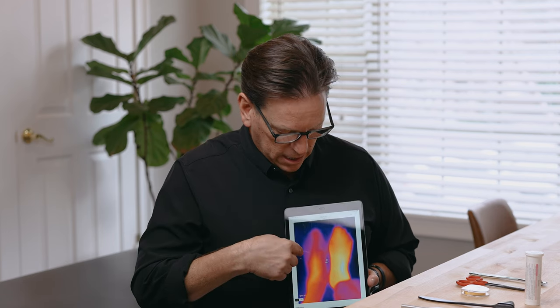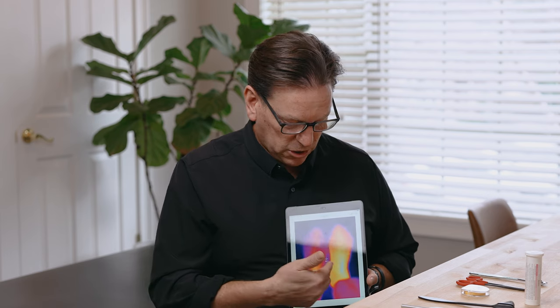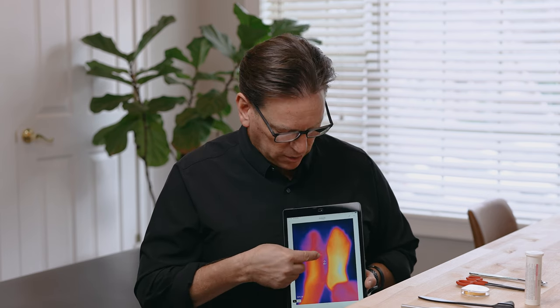The brighter the color, the more blood flow; the darker the color, the less blood flow. You can see with one of our patients here, in this part of her foot she's got pretty good adequate blood supply, but you can totally see the difference as it goes to these dark pinks and purples.